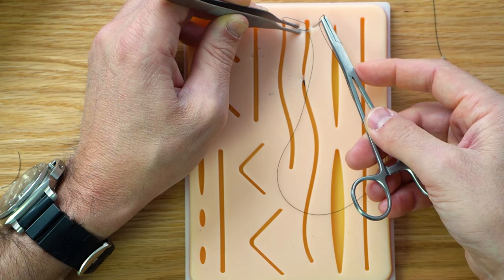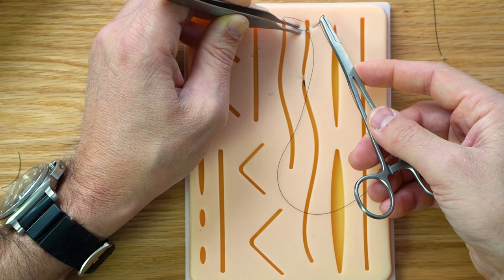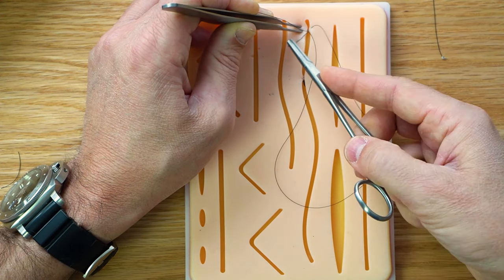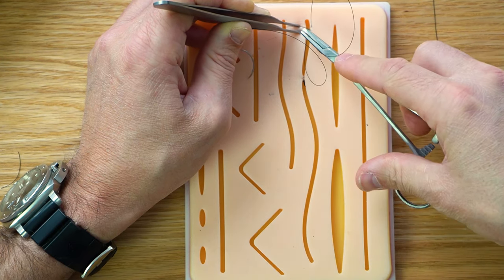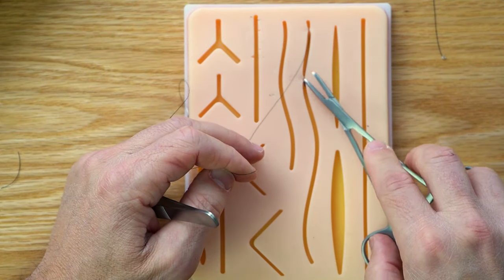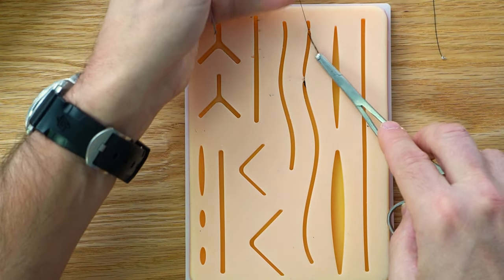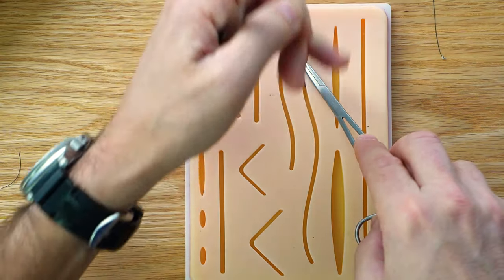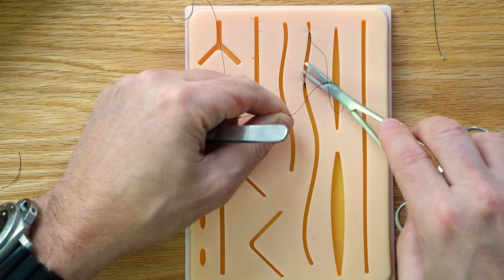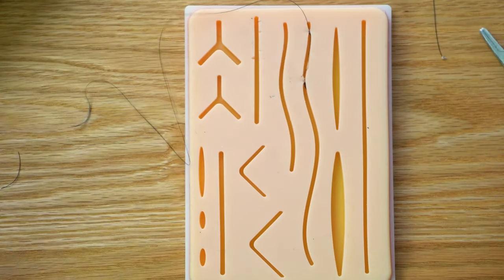Okay, if you watch my hand right there, there's a lot of turning, and it's tough to do when you have your fingers in the needle driver. And then I'm going to make sure both of them are on the same side here. Then I'm going to tie this, and this is for demonstration purposes. This is probably not going to look perfect, but I'm going to make a knot here. And if I'm starting it and it's a long incision, like what I used to use for open hernia incisions, which are a little bit longer, like an inguinal hernia, this is what I did.